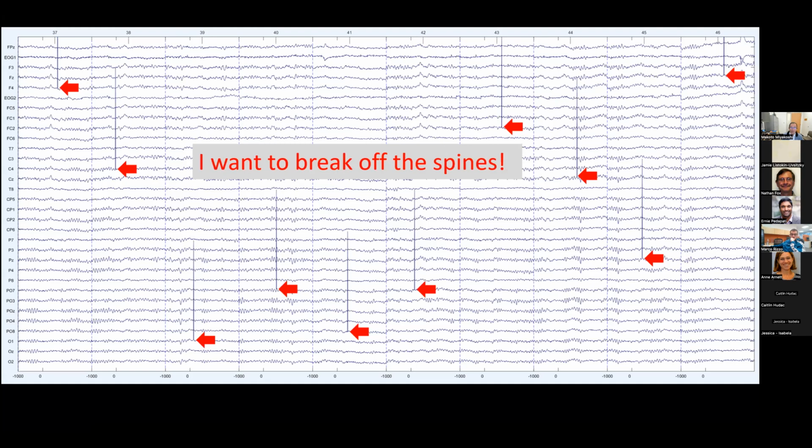And if you see this contaminated data by eye, you know what you want to do: I want to break off this spike, and I want to do some minimal makeup for that hole, and that's it, right? That's the minimum invasive approach, and we know it doesn't hurt because the duration of this spike is only like 1 frame, like 4 milliseconds, so it shouldn't matter, right?